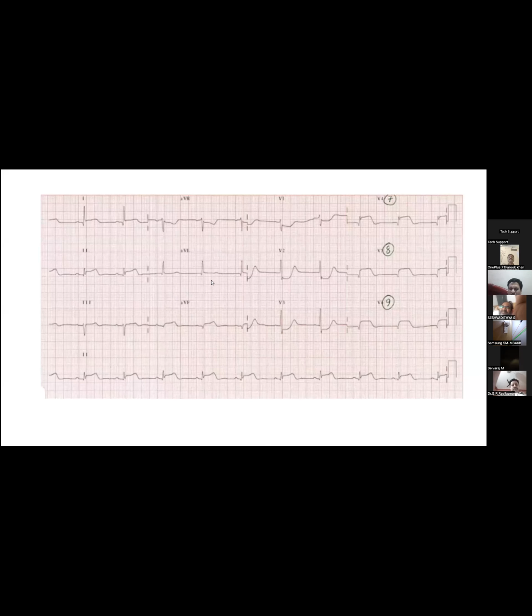Right. So now we are there. Now I don't have any headaches. We can proceed with the presentation, I believe. So V7, V8, V9 is used in recording the posterior MI in presence of inferolateral, inferior posterior or posterolateral MI. This is the special situation.